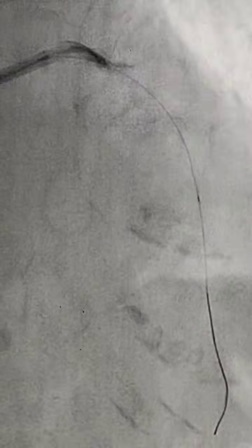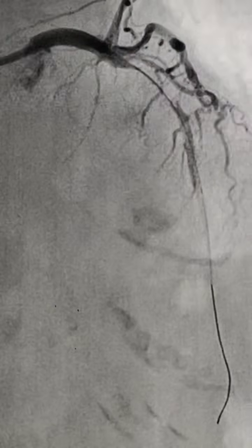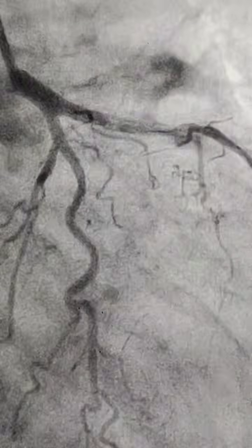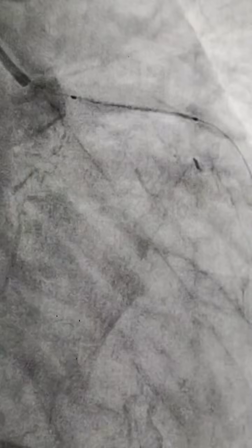There was a very tight lesion in the proximal LAD, mid to proximal LAD. Then again I did the balloon dilatation with the higher pressure. We went to RBP pressure, and now I got a flow. But I can see the place of the lesion. You can see in this RAO caudal view. So I decided to put a stent right away in that segment.